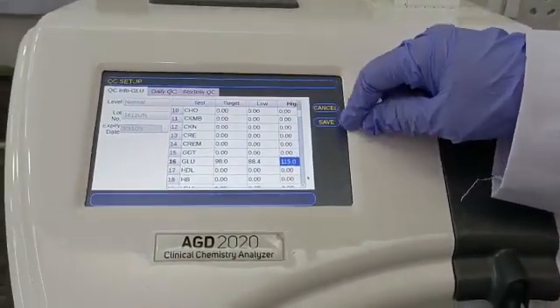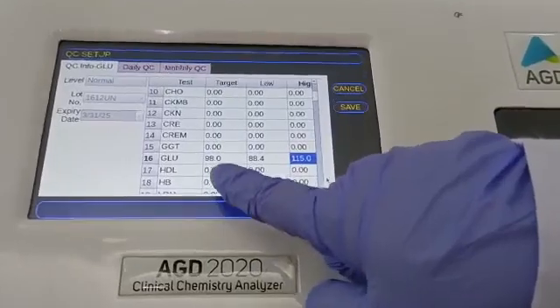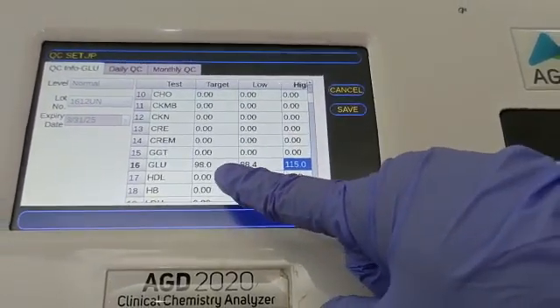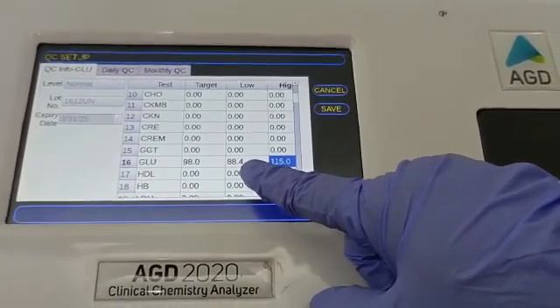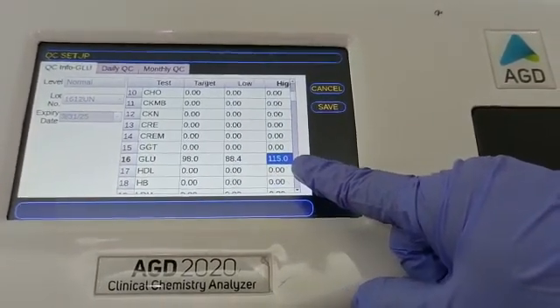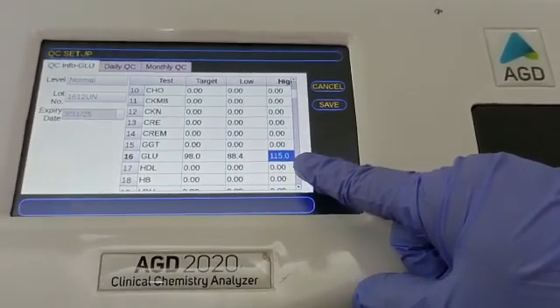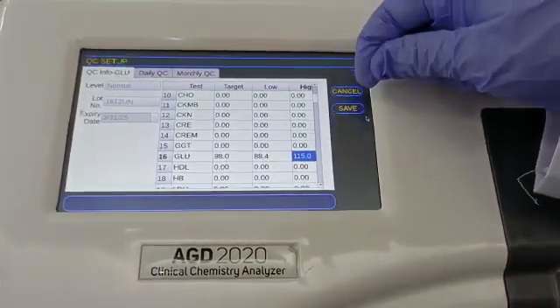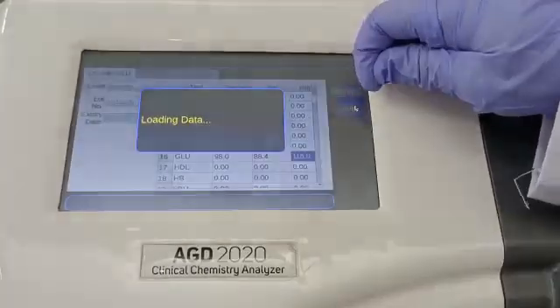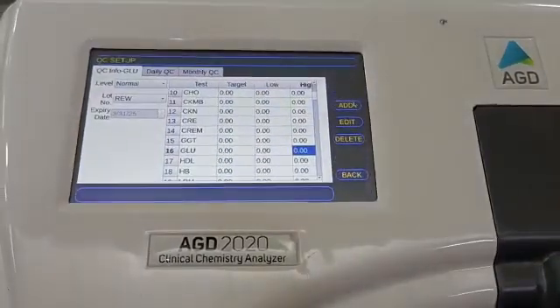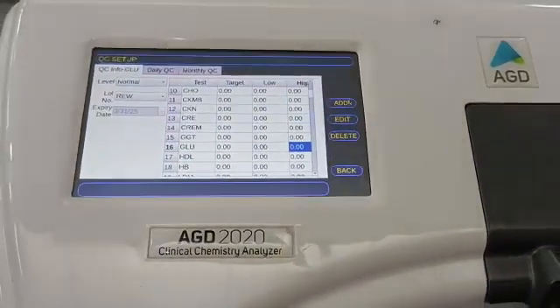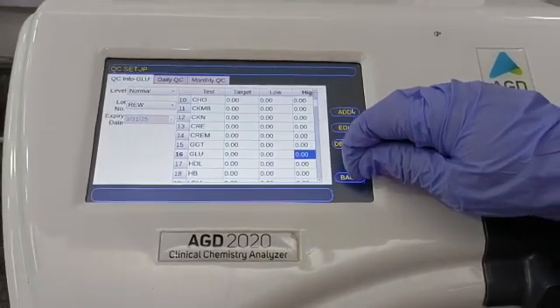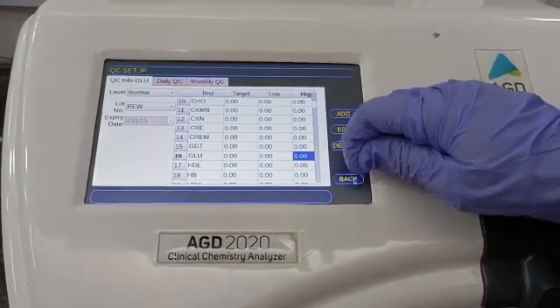As you can see, we have entered the Randox control. The target value for glucose normal level is 98, and the range is from 88.4 to 115.0. We save this value and now we can run this control.